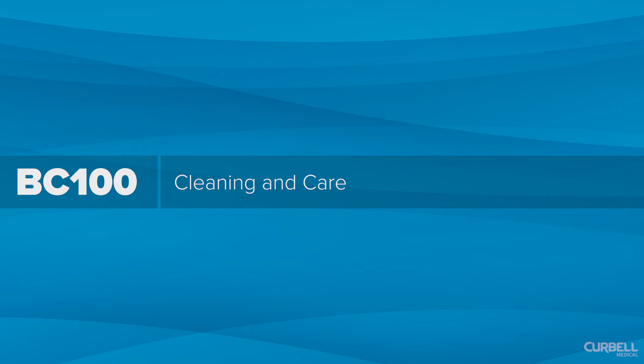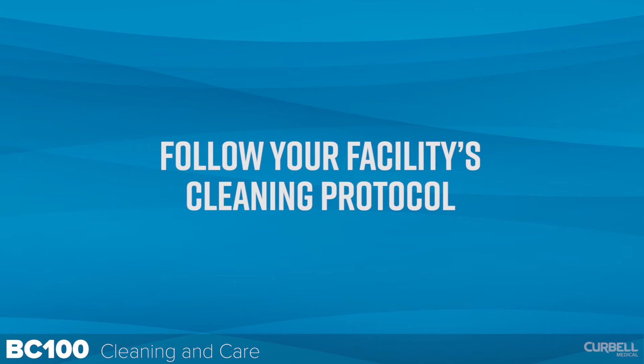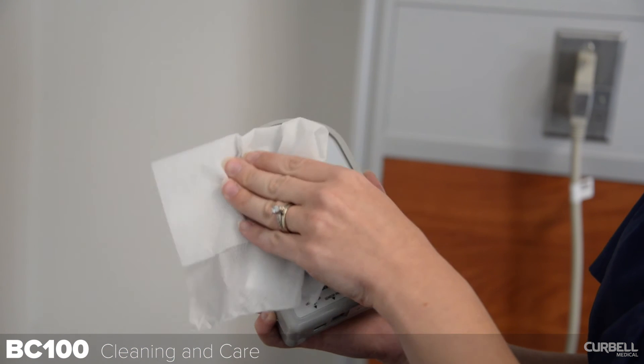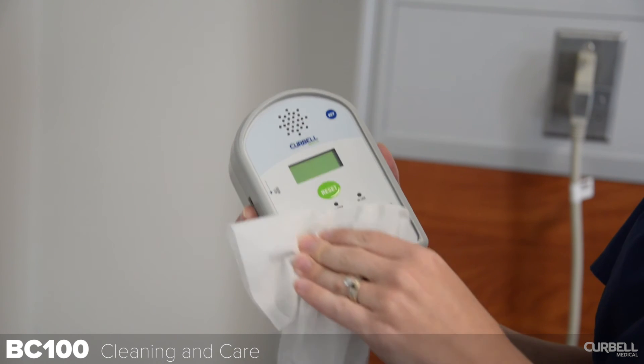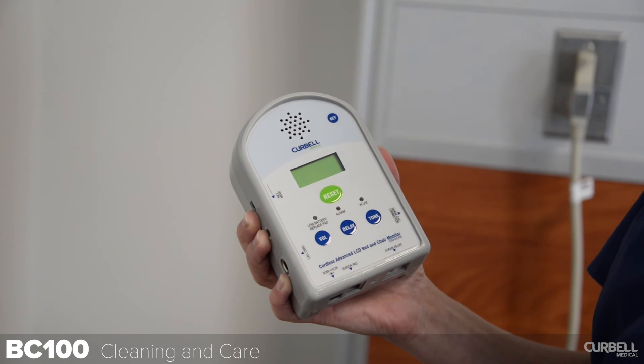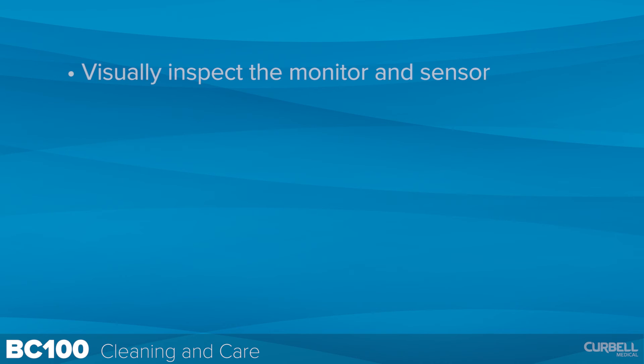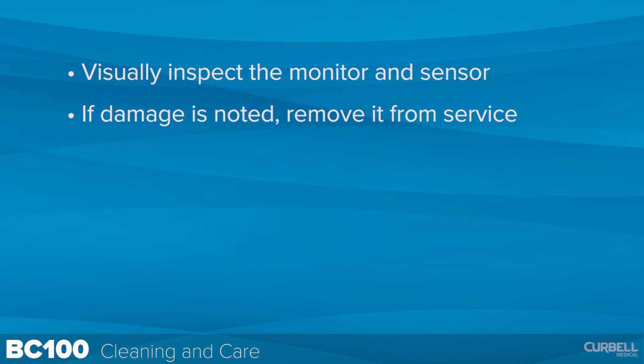Cleaning and care. Cleaning and disinfecting between patients according to facility guidelines and protocol is recommended. Use a damp cloth and clean with a non-aggressive disinfectant cleaner; do not submerge in any liquid. When placing the monitor out of service, visually inspect the monitor and sensor for physical damage. If damage is noted, remove it from service, disconnect all cords, and lay sensor pads flat.